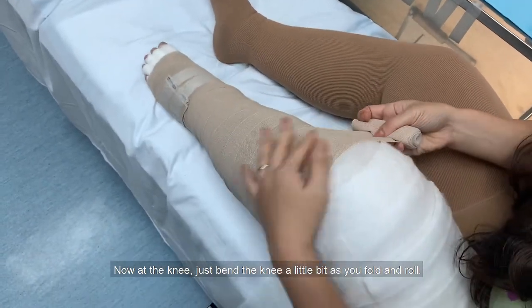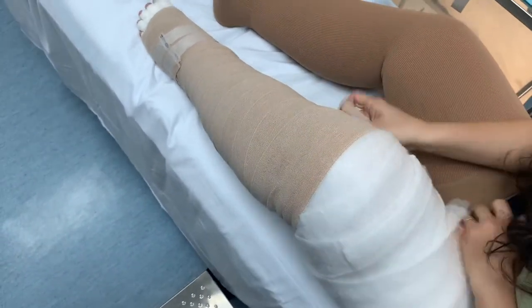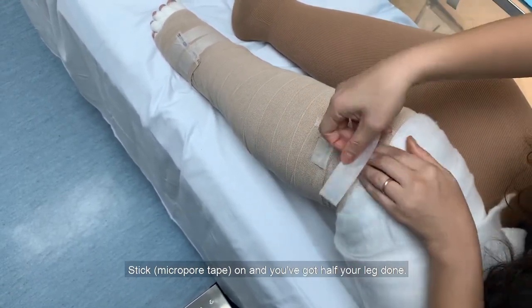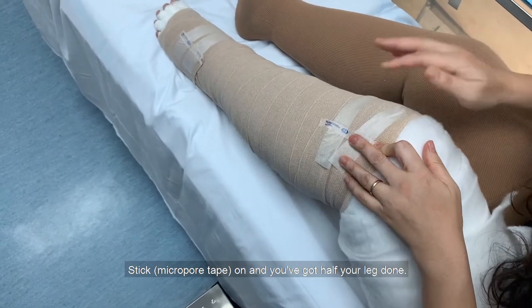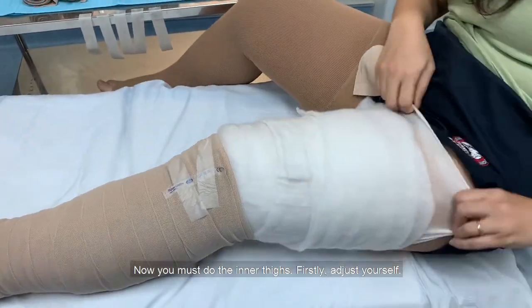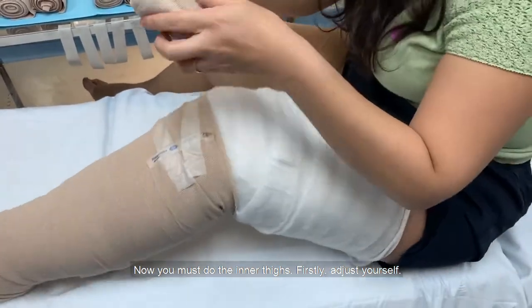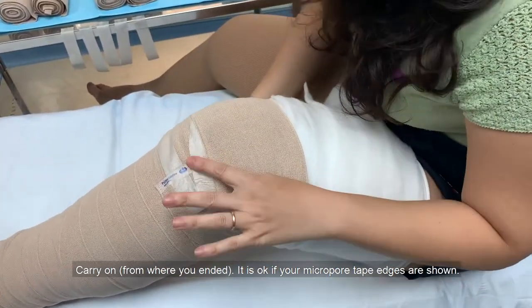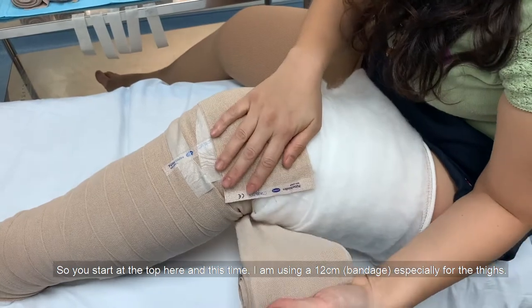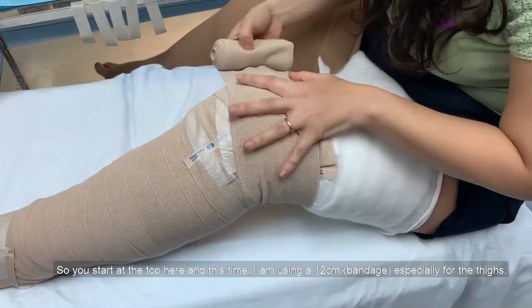At the knee, just bend your knee a little bit as you fold and roll the bandage. Secure it with tape and you've got the lower half done. Now we'll move up to the thighs. This time I'm using a 12cm bandage, especially for the thighs.